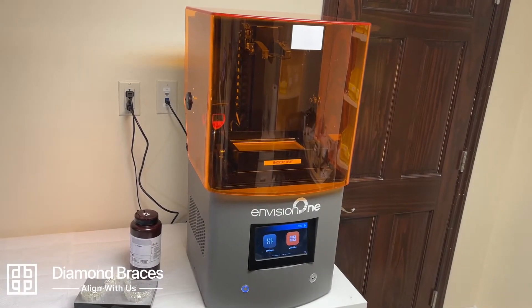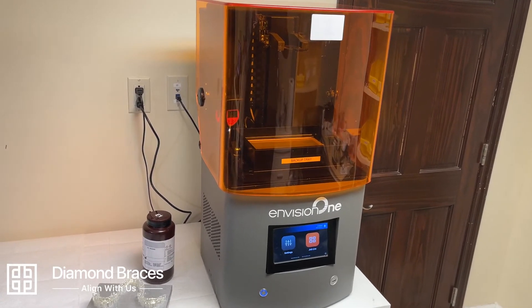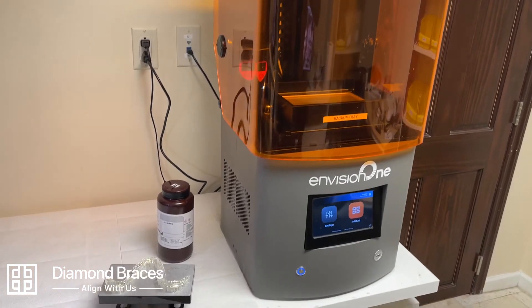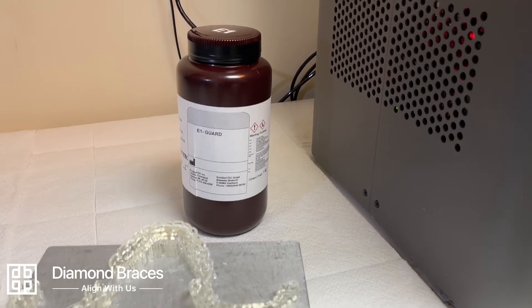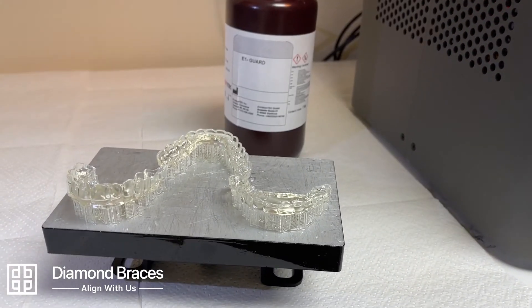Your night guard is printed on the Envision One Dental Printer, the most advanced 3D printer utilizing the latest technology, making it perfect for printing your 3D orthodontic appliance. The appliance is printed from eGuard 3D printing material, an FDA-approved and biocompatible crystal clear material.